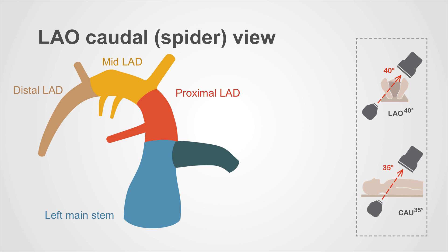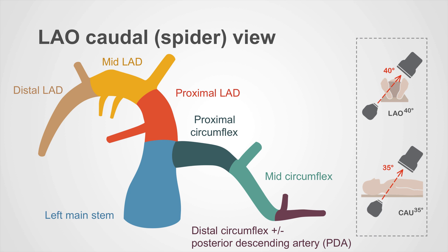The proximal circumflex artery again comes off the left main stem, as discussed earlier, and the circumflex tends to head to the right-hand side of the screen in the LAO caudal or spider view. Here you can see the proximal circumflex becoming the mid-circumflex, and then the distal circumflex, and again the posterior descending artery if this is a left-dominant system.